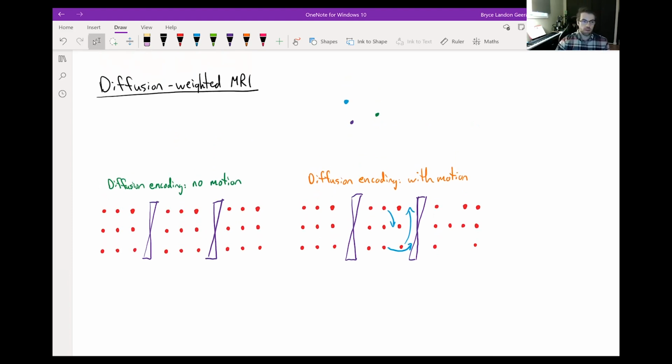So diffusion-weighted MRI first. Last session we were talking more about T1 and T2 weighting strategies, and also covering a little bit about how we image quickly, so things don't take forever. And diffusion-weighted imaging, generally we can think of as a T2-weighted sequence, but the technique aims to measure the diffusion of water, which I imagine you could have guessed.